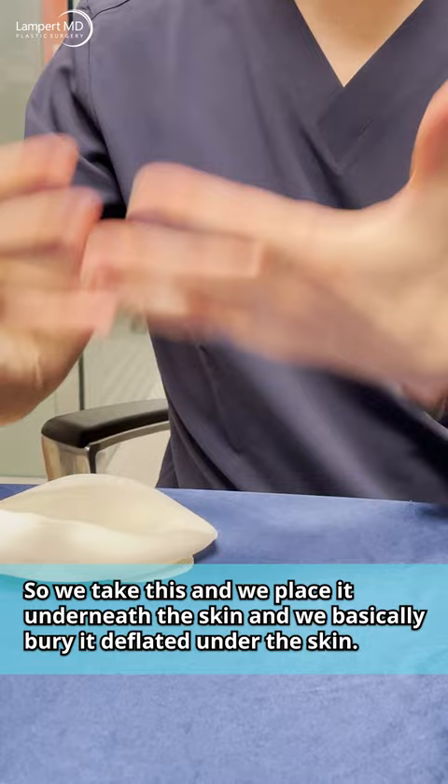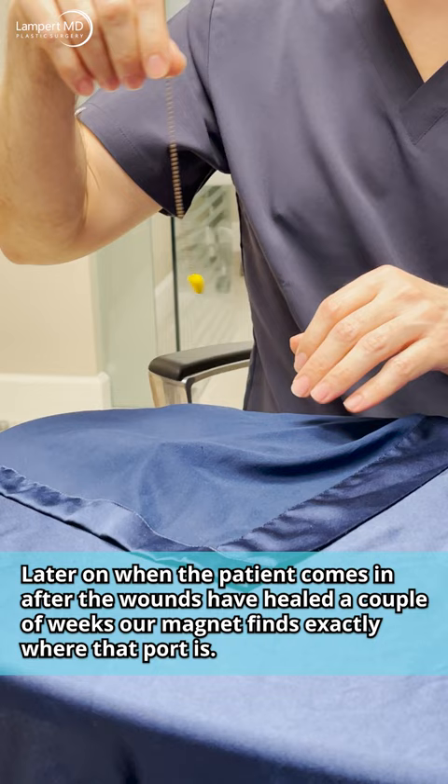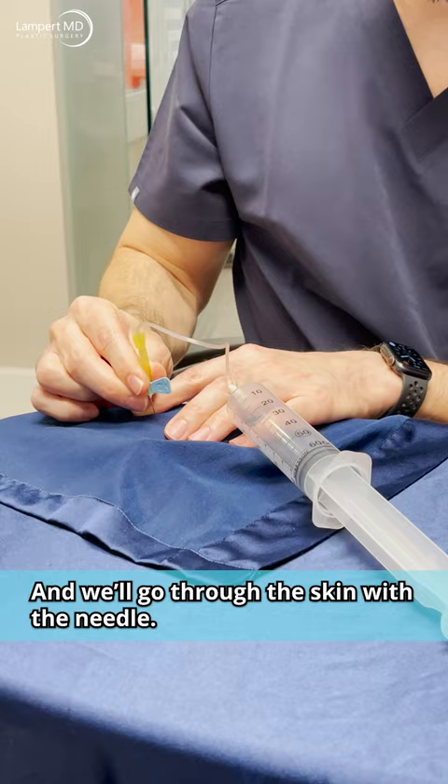We take this and place it underneath the skin, burying it deflated. We're just using this silk drape to simulate the skin. Later on, when the patient comes in after the wounds have healed a couple weeks, our magnet finds exactly where that port is.